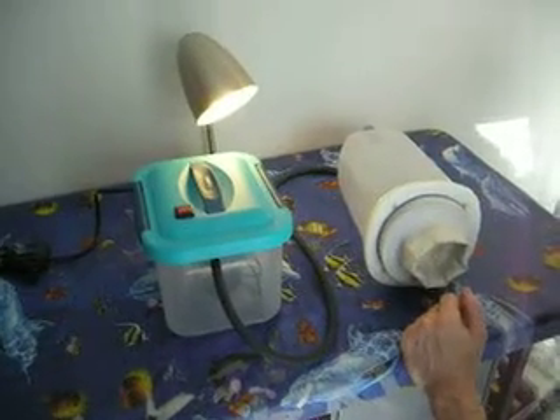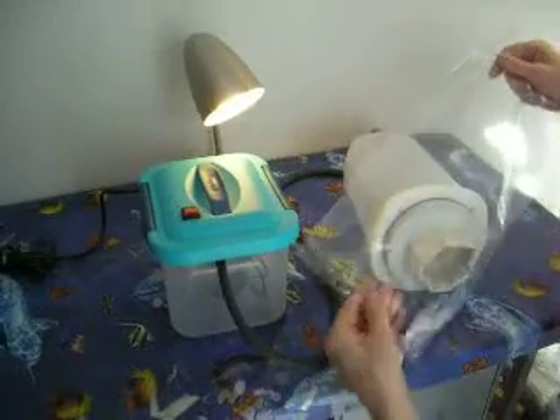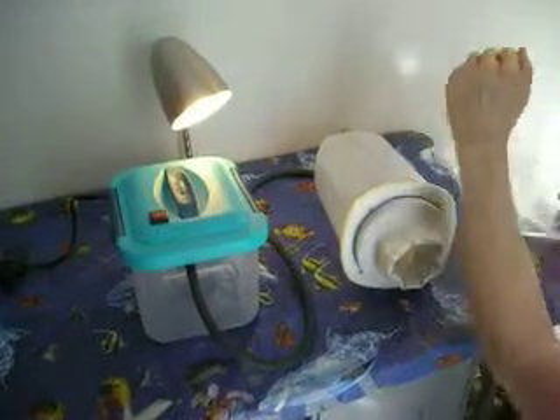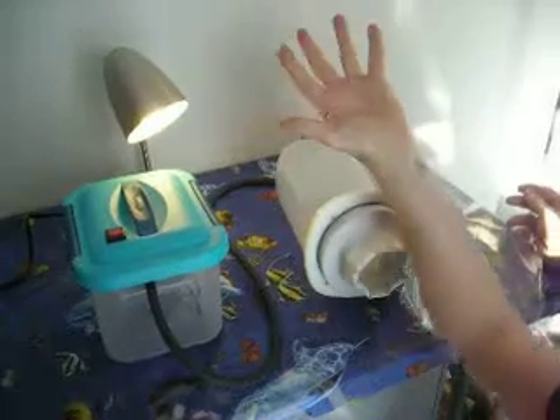The patient is fitted with a plastic sterile bag over his limb. As you can see, the extent of vasodilation in my hand at the present time.